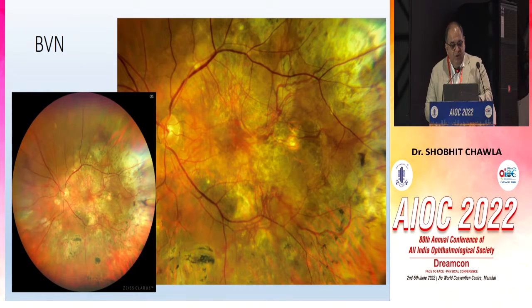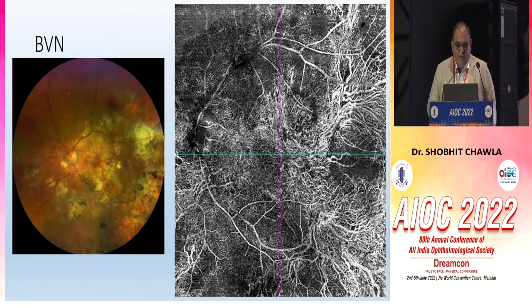You first do a whole image. Those are some areas which I have lasered also with polyps based on ICG, and when you look at the central magnified image, you see the branching vascular networks which have matured, and such networks have lesser chances of bleed. So imaging combines so much information, so much follow-up care, and so much treatment.